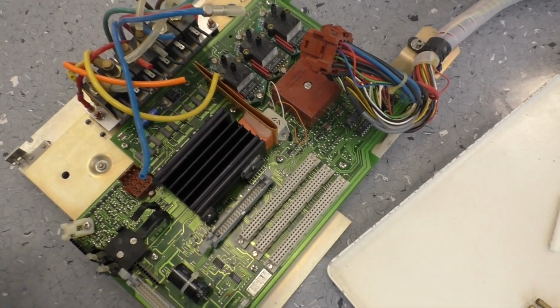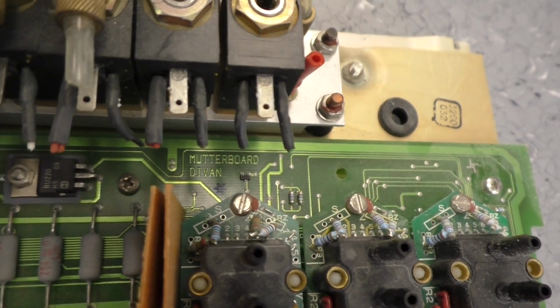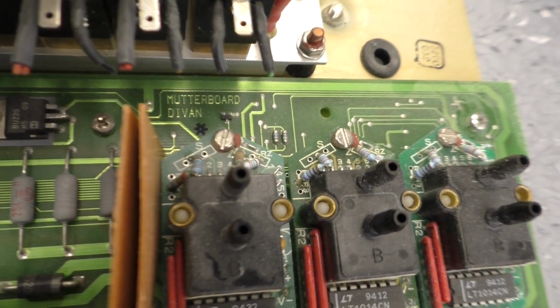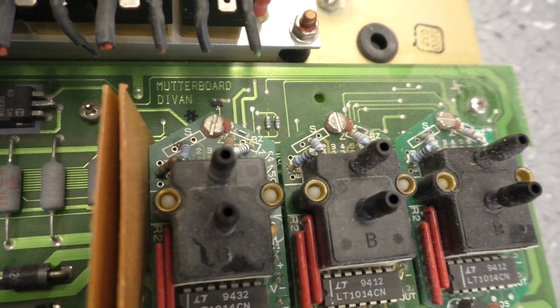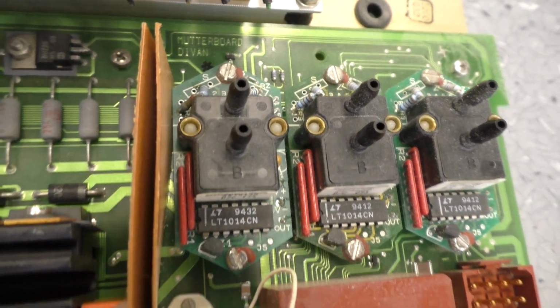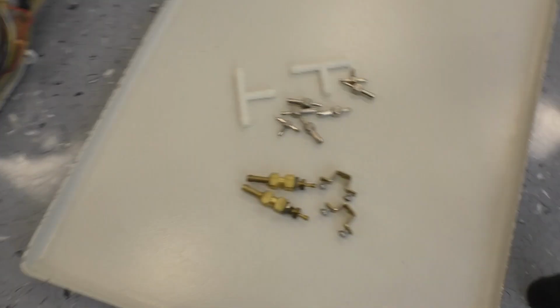Okay, that's the motherboard. Can you see that? They couldn't decide if they want to speak German or English. They called it Mutterboard. Okay, the Divan motherboard.